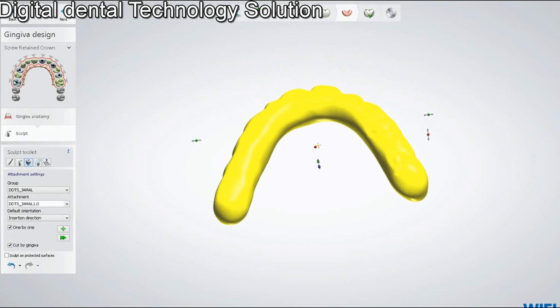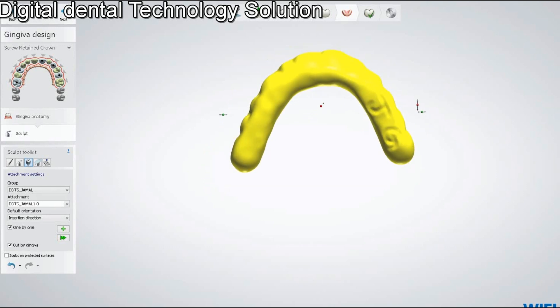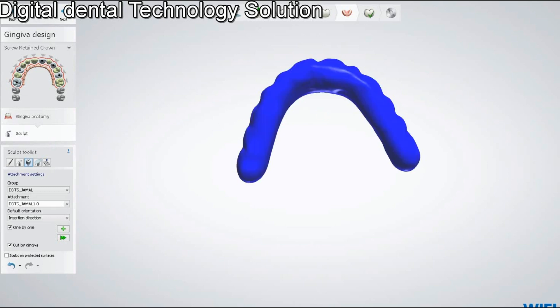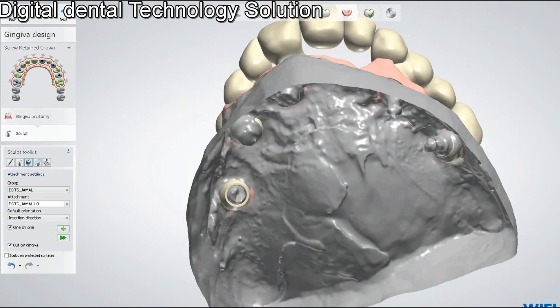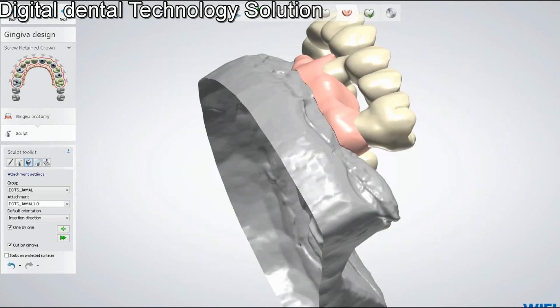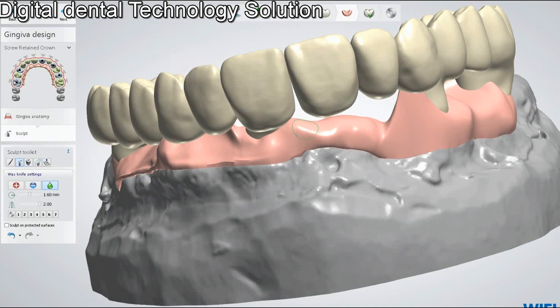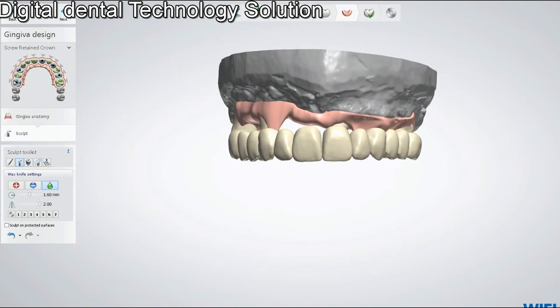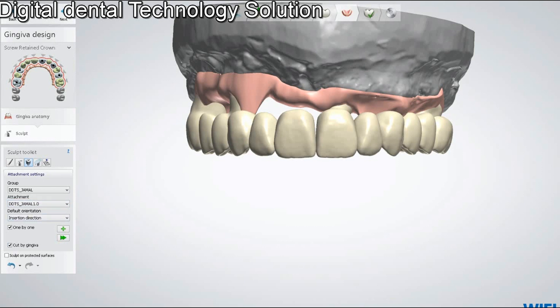Welcome to Digital Dental Technology Solution. This video will explain how you can use a gingival attachment to make full hybrid cases. This is the attachment — we already have a case where we made the gingival. If you try to make the gingival manually it will take too much time, so we have a new way: we can add the attachment and make our life easy.